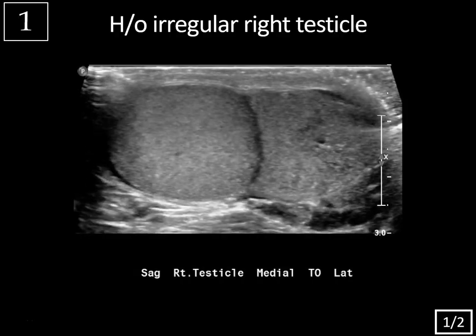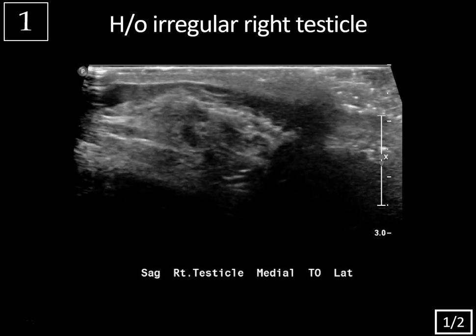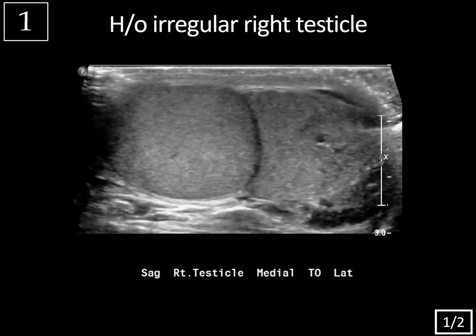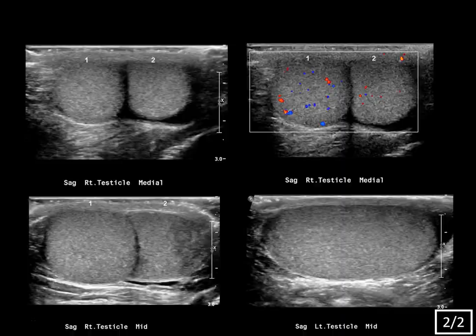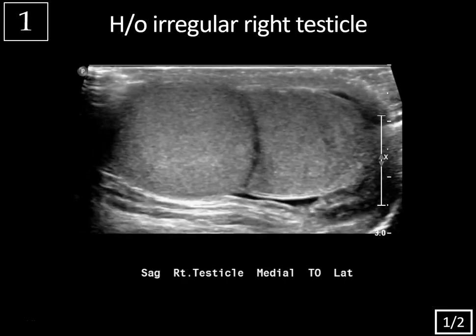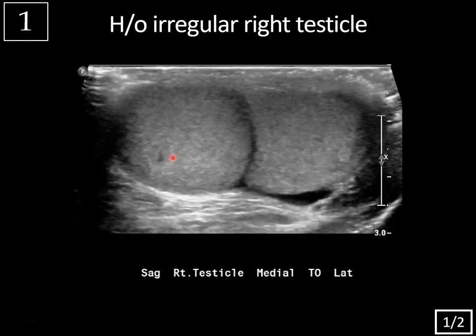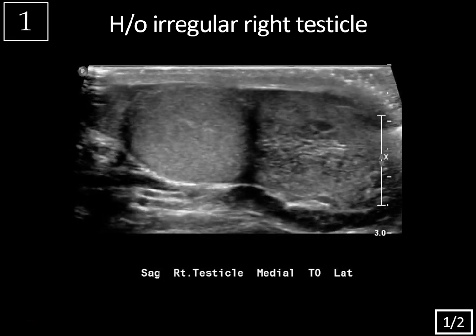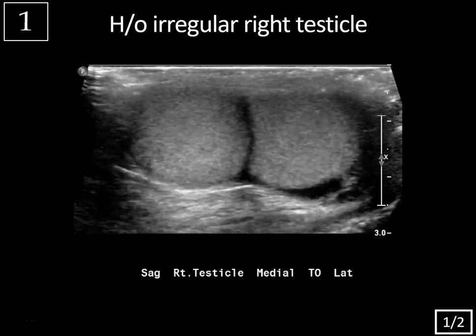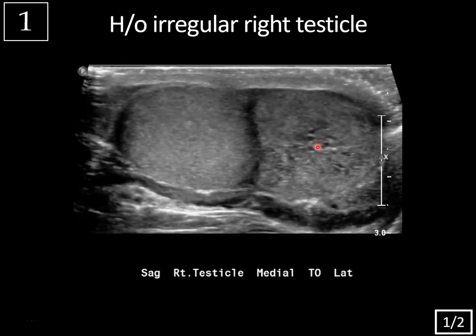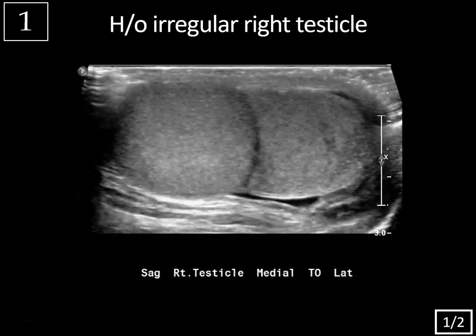Case 1: History of irregular right testicle, CineClip, slides 1 and 2. On this sagittal cine clip of the right scrotum, you can see that there's a normal appearing testis here, and then there's another testis with mass effect against it. There's also a tubular cystic area within the area of this testicular mediastinum, indicating tubular ectasia of the rete testis.